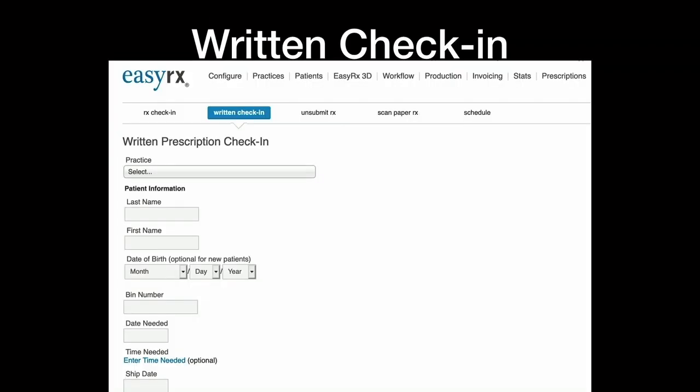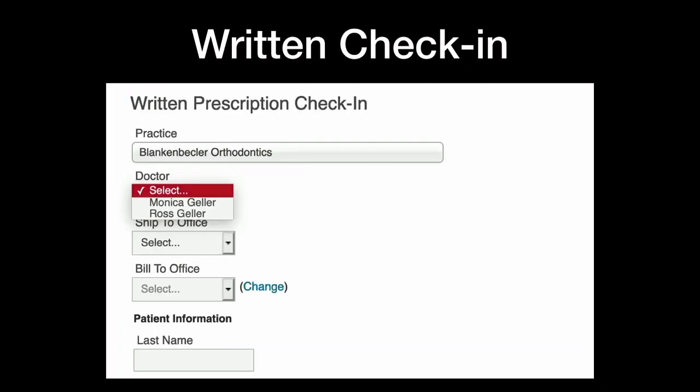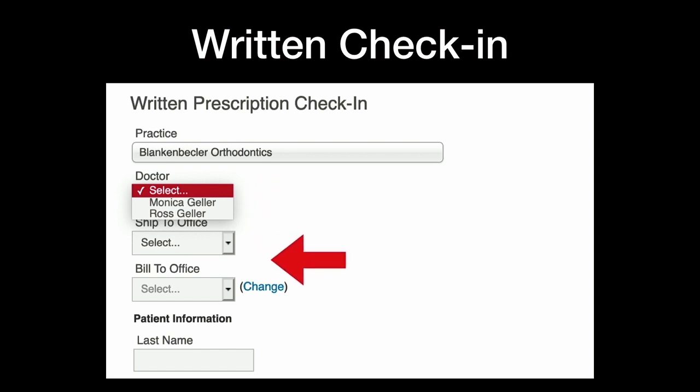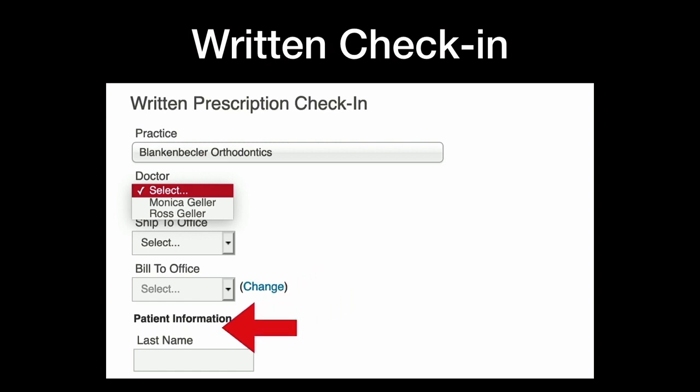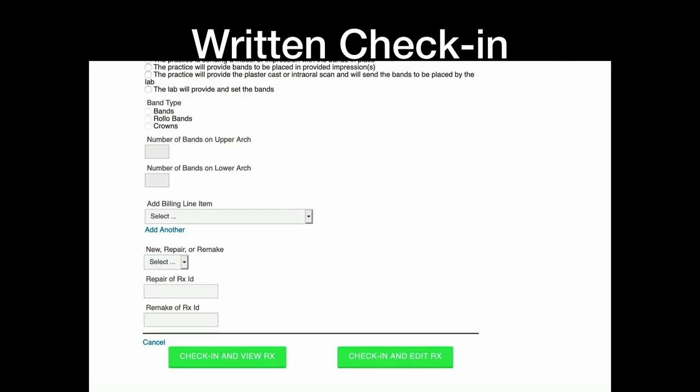So written check-in, the left side here. Same thing, but you choose the practice, and you can choose the doctor, you can choose ship to office, bill to office. So all those you enter in or the doctor enters in, and they say deliver on this date but to this office. And the great thing is when you go to check them out, it will invoice out and give you where to ship each batch and give you a list. So you don't have to accidentally ship appliances to the wrong office and vice versa. And of course they type the name in.